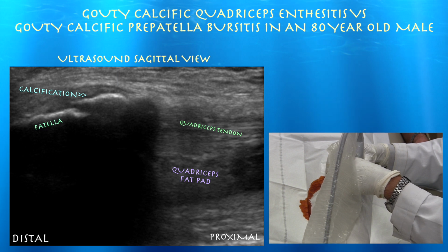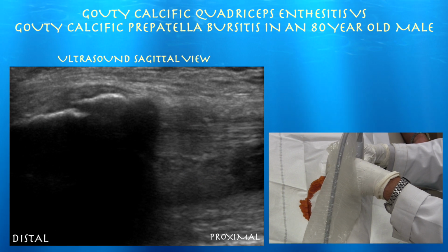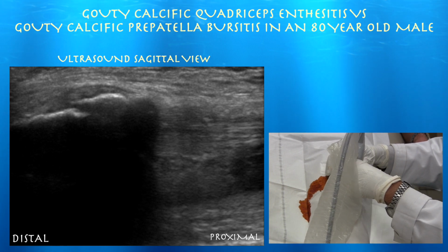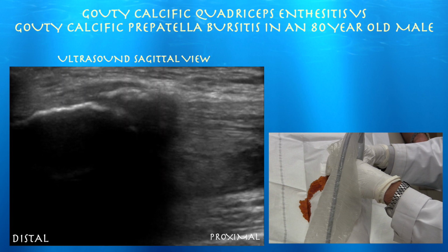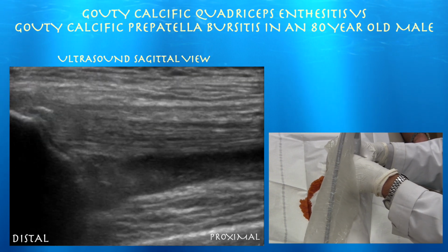So what I plan on doing is trying to break up that calcium with a needle, injecting it with some saline, and then injecting some cortisone around it. I'm going to use only about half what I normally use of cortisone, given the fact that it's right on top of his quad tendon. But again, we're not going to inject his quad tendon itself, we're just going to go superficial to it, so I don't think I have to worry too much about weakening his quad tendon. But we'll still be cautious and use half the dose. And he is tender right at that calcification, so I believe that is his pain generator. Otherwise, the quad tendon itself looks pretty good.